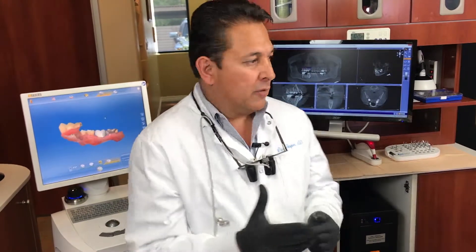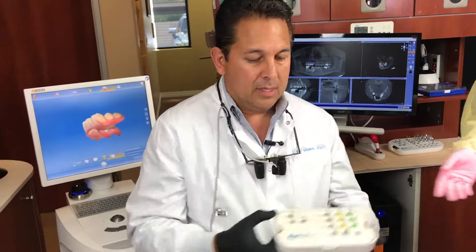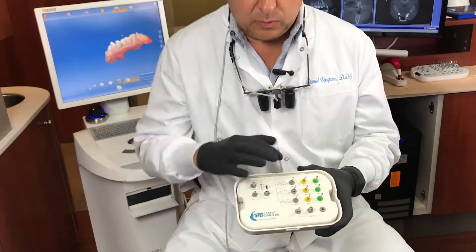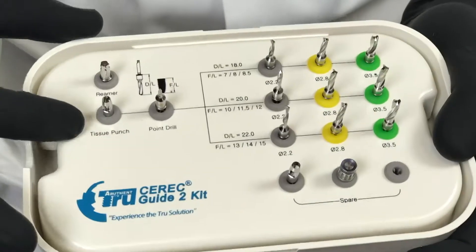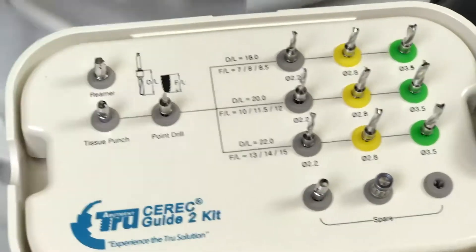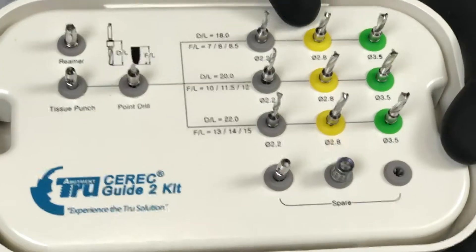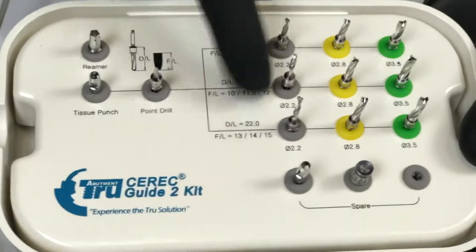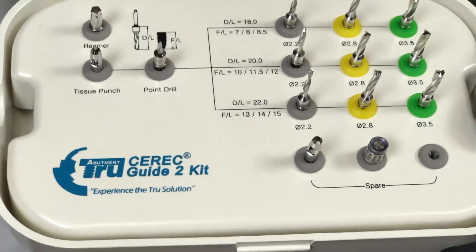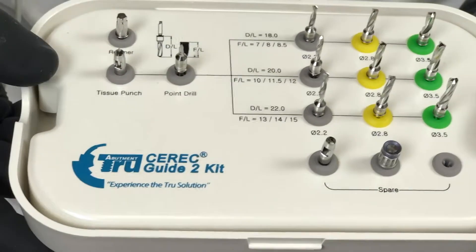I made a first video with the first kit — let me show you how that kit was. This was the first kit. I really liked it because it comes with a tissue punch, the point drill, and it came with three different sizes in diameter and also in length. It was very good, but now let me introduce the new kit.